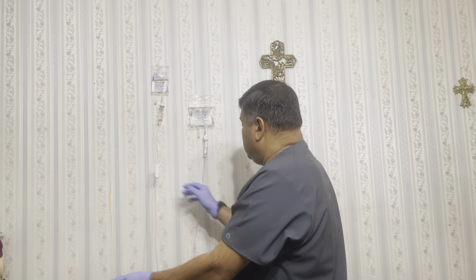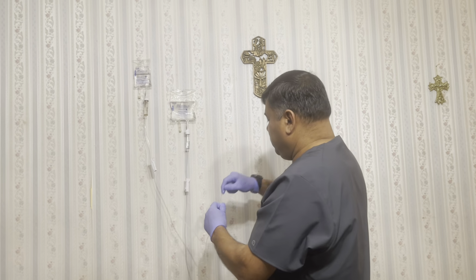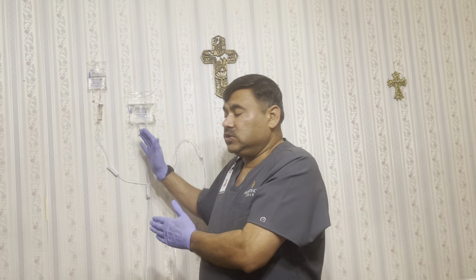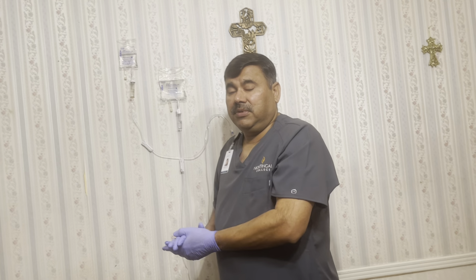I just did that. I'm putting this in my patient. I have just put this medication in my patient, and I'm showing that it's done. One thing: before starting, before priming my secondary tube, I'll hold my fluids for a minute, so that there isn't any mixing of things and it will be safe. Once I've primed my secondary tube, then I'll open up my fluids, and I will do my drop factor, since 100 ml I have to give. I will count for a whole 1 minute. That's what I was trying to explain.